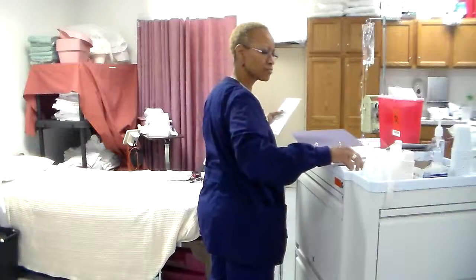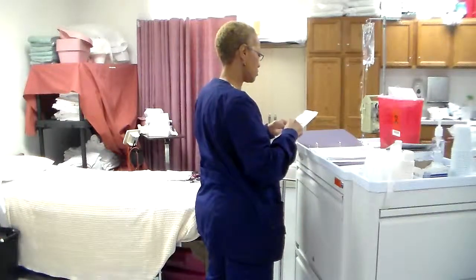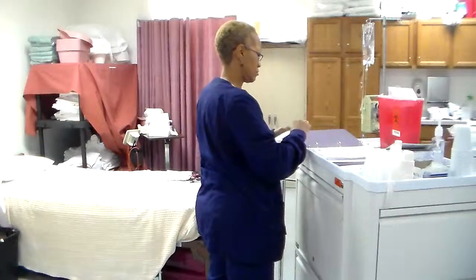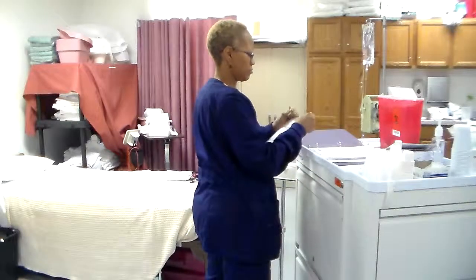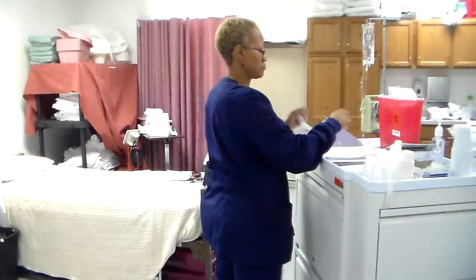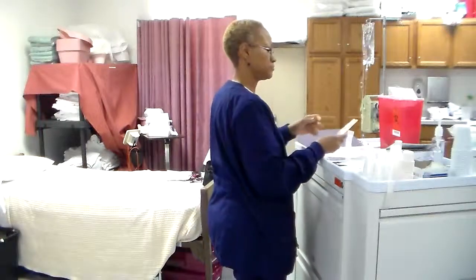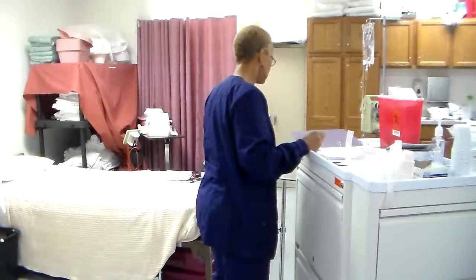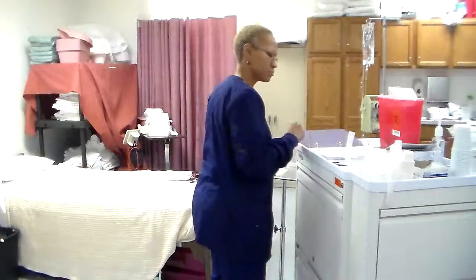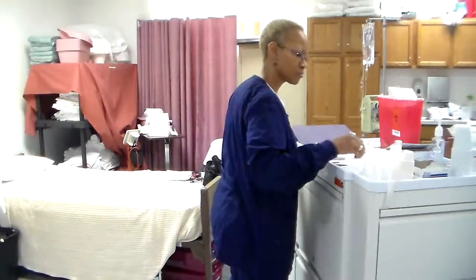First check. Be sure to compare the label of the medication with the MAR. Prepare medication. Second check. Assemble medication and supplies and take to bedside. Prepare client by informing client that medication will be given through present IV line.